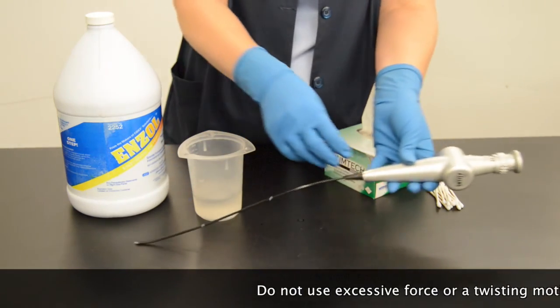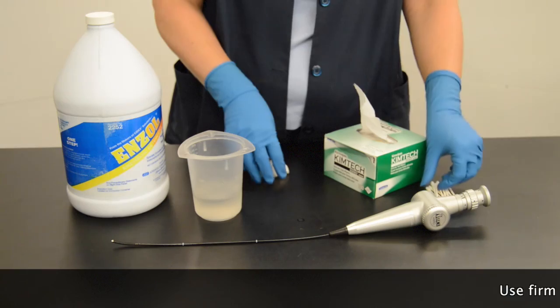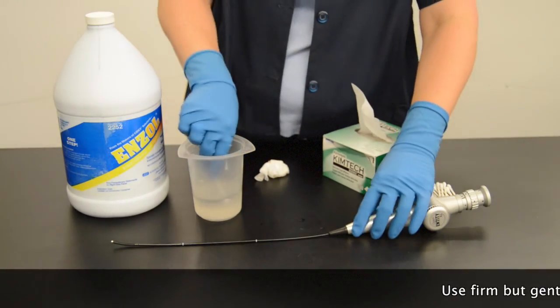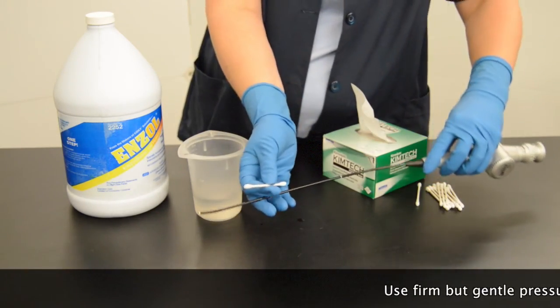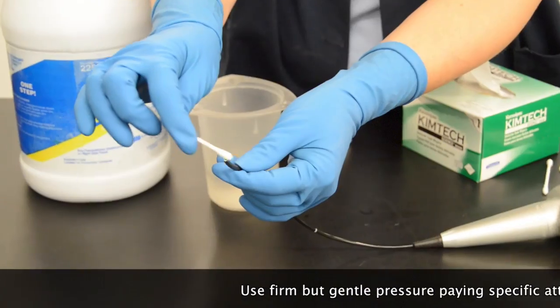Gently wipe all debris from the insertion tube and distal tip using a soft, lint-free cloth and water to which you have added a low-sudsing detergent, diluted in accordance with the detergent manufacturer's instructions.